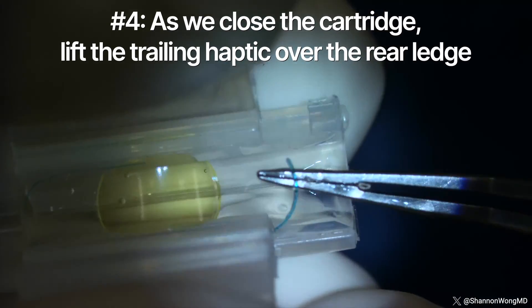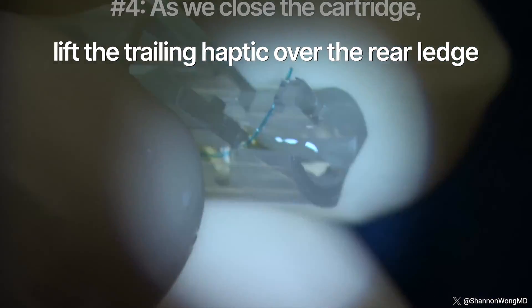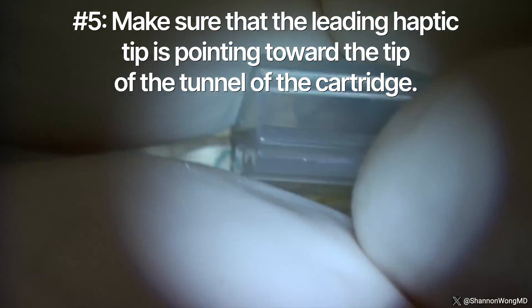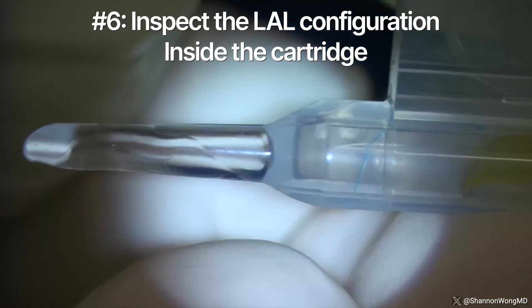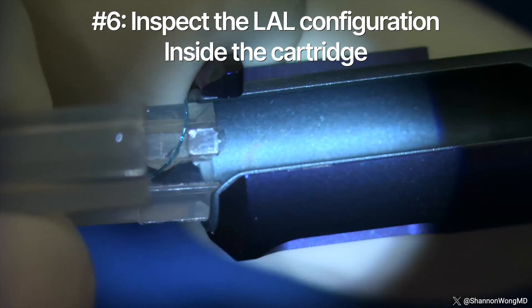Number four: as we close the wings, we bring the trailing haptic up over the rear ledge of the cartridge. Number five: we also check to make sure that the leading haptic tip is pointing toward the tip of the tunnel of the cartridge. Number six: the wings of the cartridge are then brought together and the configuration of the lens and haptics are visualized to make sure that the leading haptic is pointing toward the tip of the tunnel.